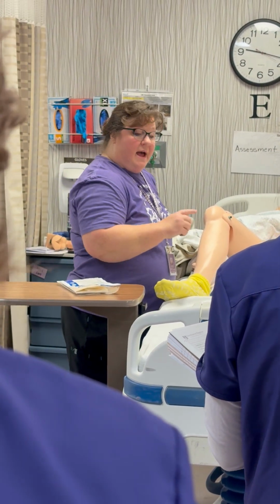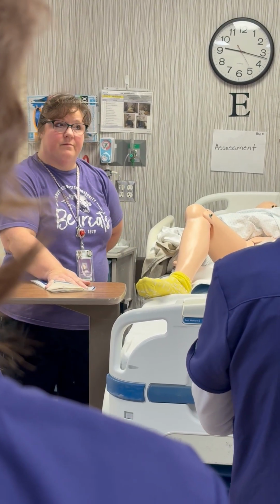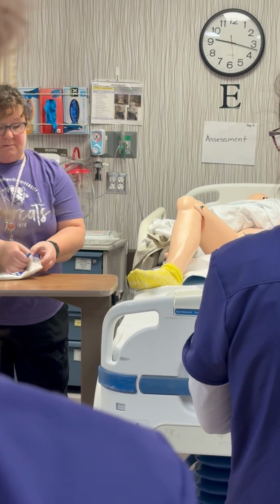All right, so now after I got this, I see that my gloves are there. Now it's glove time. Everybody understand that? Okay, so now I put my gloves on.